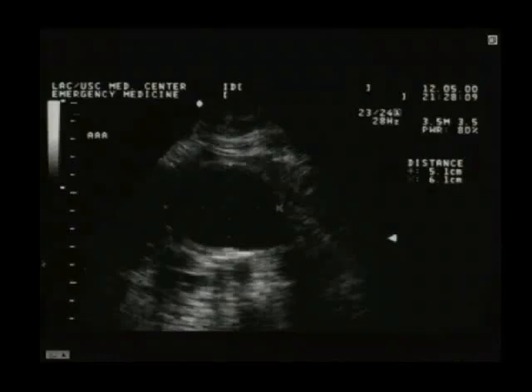So here we have aneurysms now. We have a saccular aneurysm over here on the right side, and we have fusiform aneurysms. Remember, almost all these aneurysms will be below the renal arteries. Here's a large aneurysm. This is a still image, large aneurysm. This is actually measured there. We have the cursors there, 5.1 centimeters by 6.1 centimeters. So obviously large, something we need to worry about now.